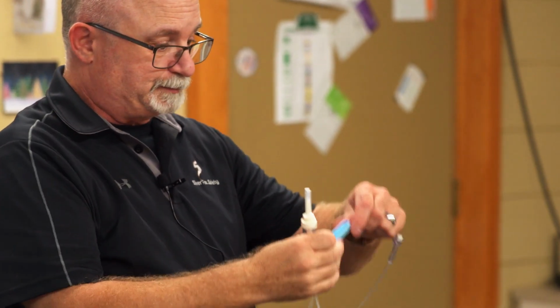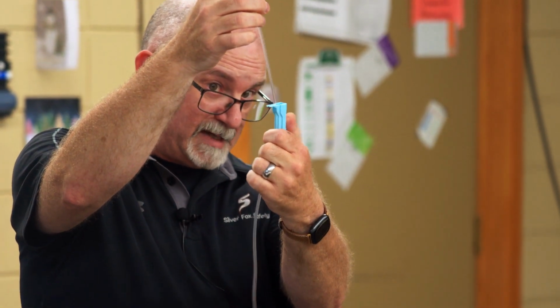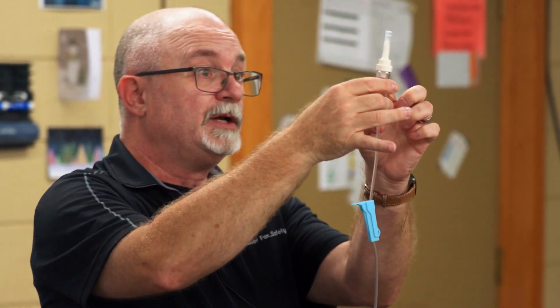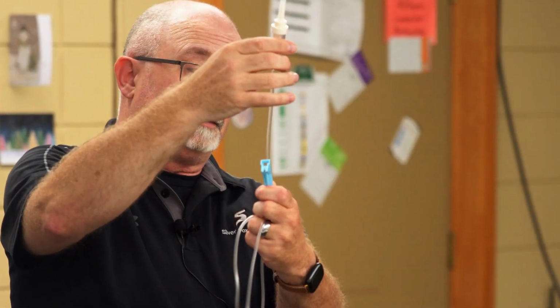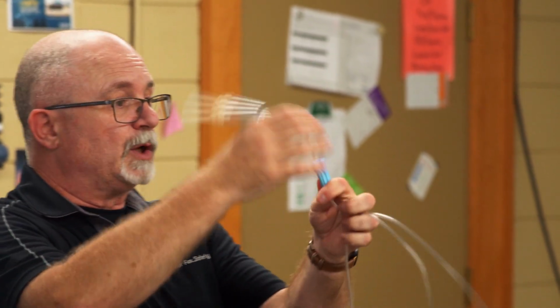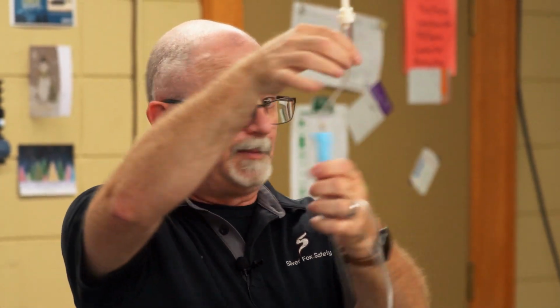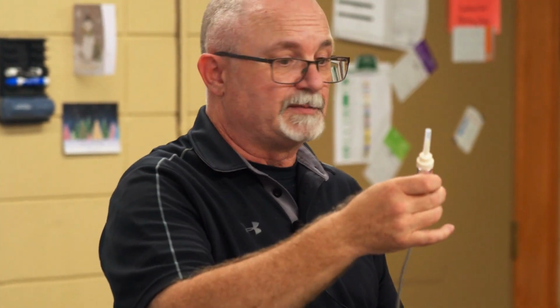Two different theories on this. So this is your roller clamp. This helps you control your flow. Once your bag is hung up, if you keep rolling this roller clamp down, it completely occludes it, and you'd have no flow coming through here, nothing going downstream, okay? If you roll it up a little bit, and I'll show you again in a little while, the more you bring it up, you get a couple of drips. But the location of this, do you want it up by the drip chamber, or do you want it low down where the patient is? Totally preference. It's up to you. I generally put it up here, but it doesn't matter.